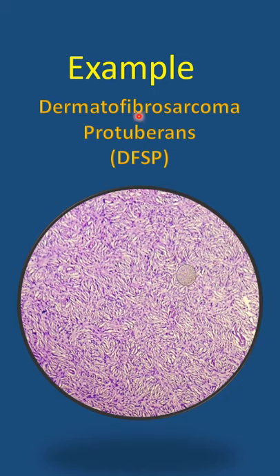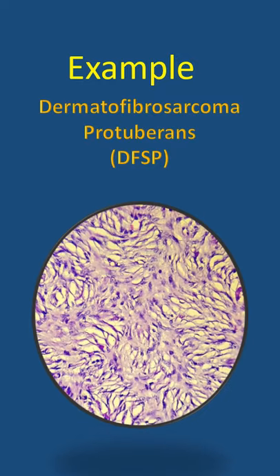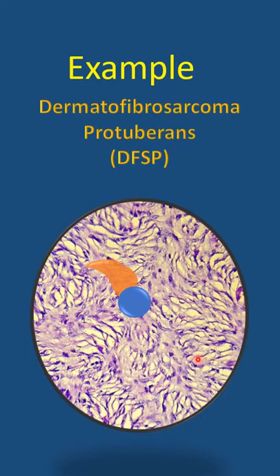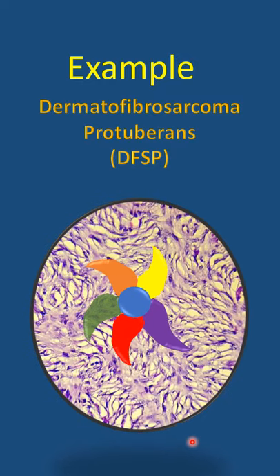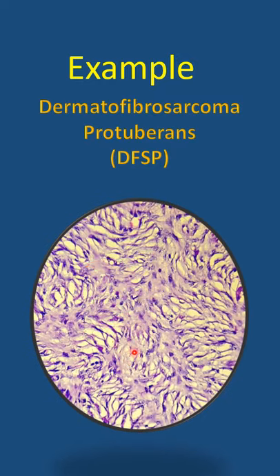An example for this pattern is Dermatofibrosarcoma Protuberans. This is a high power view, and if you observe the spokes of the pinwheels, this is the pattern that is formed by the tumor cells. Tumor cells are basically spindle cells.